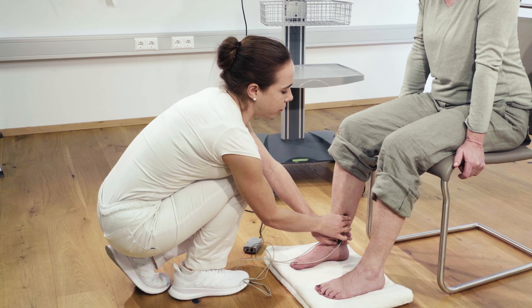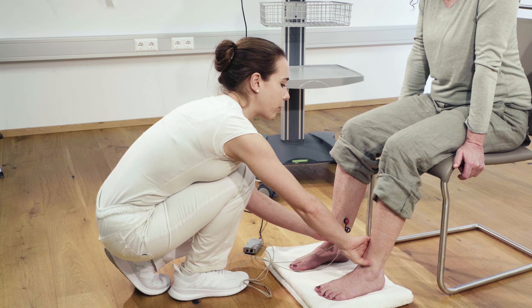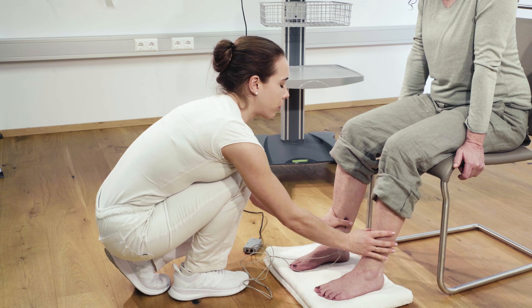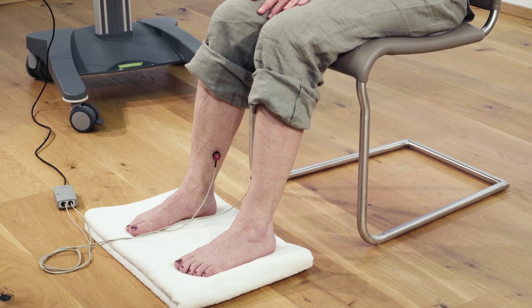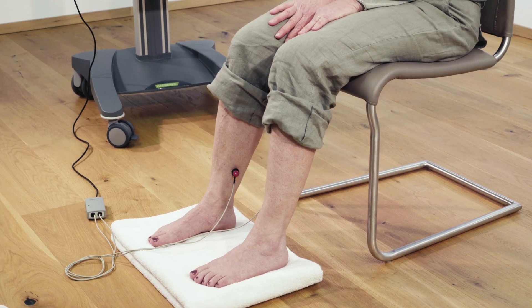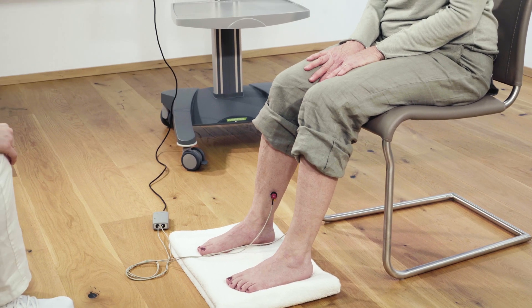The sensors are ideally placed 10 cm proximal to the medial malleolus with double-sided adhesive rings. Make sure that the measuring point is free of excessive hair and creams. The red sensor with the inscription R is placed on the right leg, the blue sensor with the inscription L on the left leg. The sensor cable should be directed downwards.